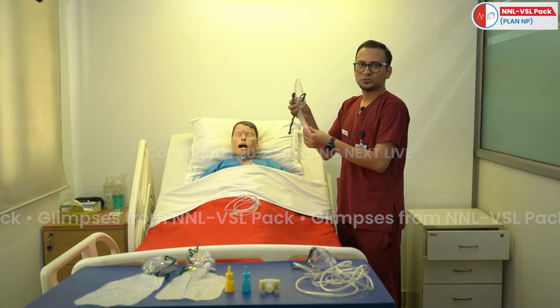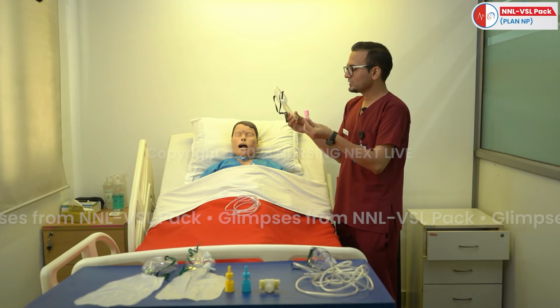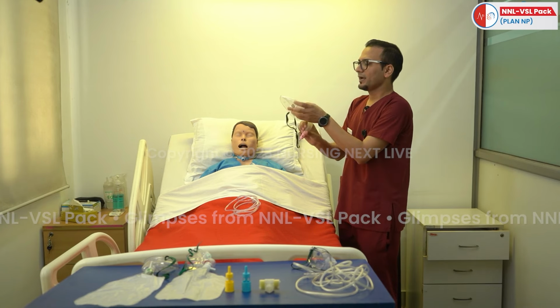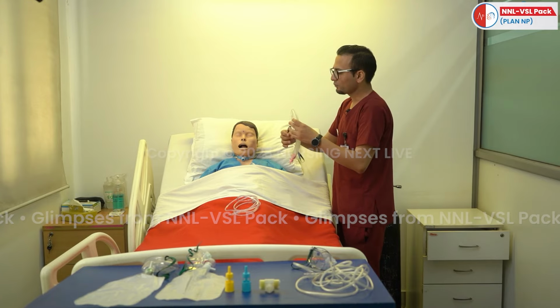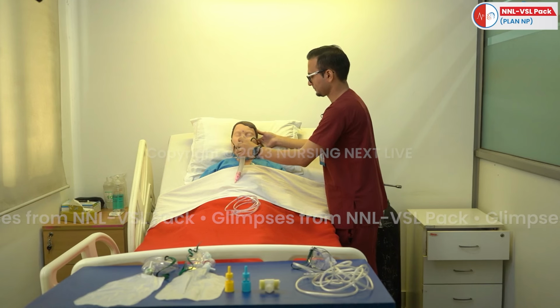This is known as the Venturi mask, and this portion is known as the venturi. We are going to connect this venturi with the end portion of the Venturi mask. And the mask we are going to attach over the nasal and the oral cavity, meaning we have to cover the nose and the oral cavity of the patient with the help of this mask.